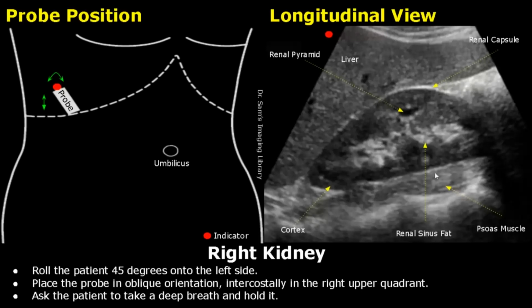Behind the kidney, we may sometimes see this muscle. This is the psoas muscle.